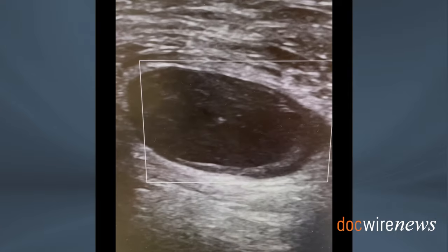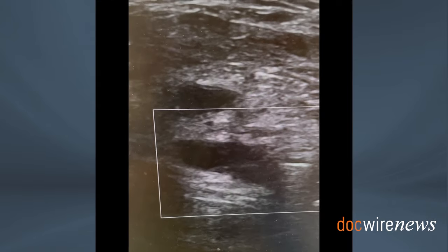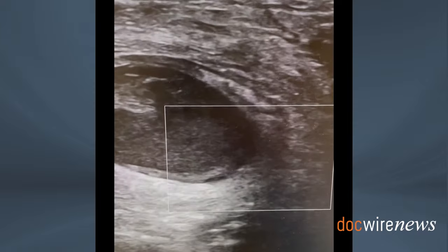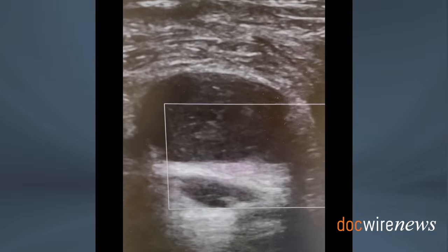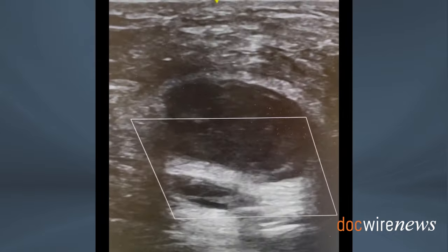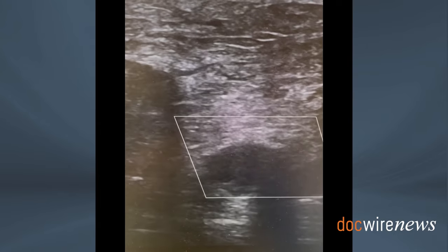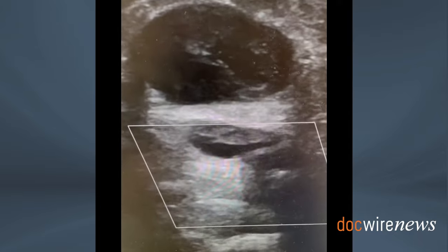This procedure is very meticulous and any injection should be done very slowly. As you see here, the large cavity had thrombosed — it is completely free of any color. However, with thorough evaluation by ultrasound, the lower cavity had not been completely thrombosed. You can still see there is an area at the bottom of the lower cavity still connected to the artery and still pulsating, despite manual compression with the ultrasound probe.